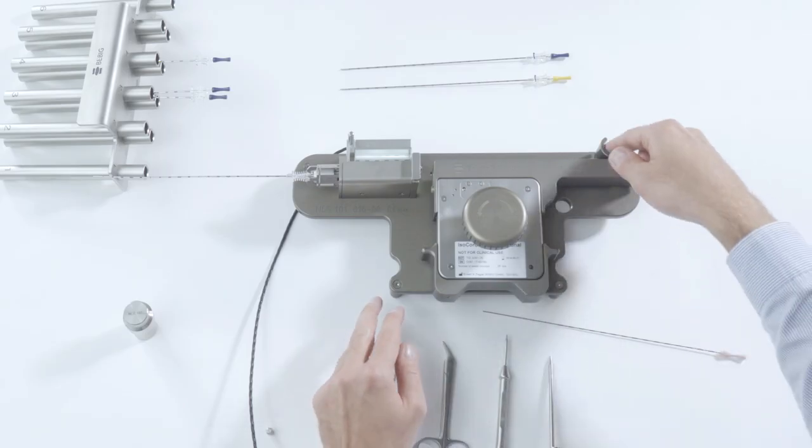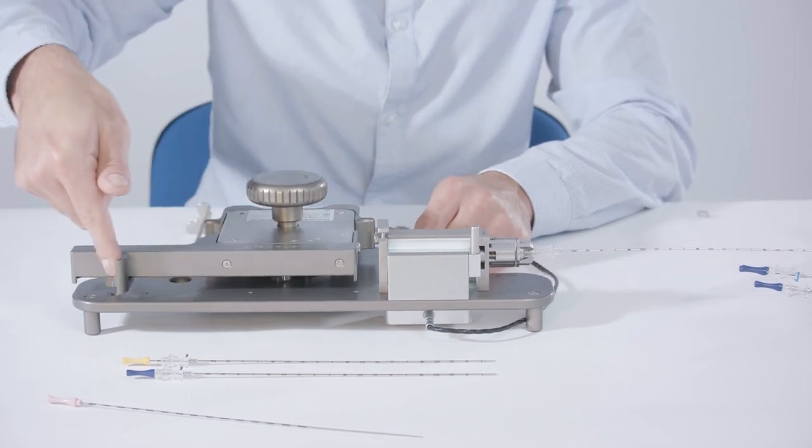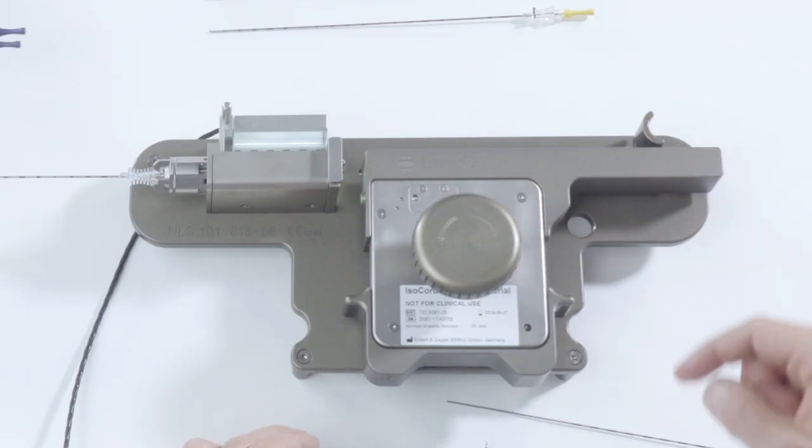Push the stylet by its handle as far as it will go and then return it to its original position in order to load the attached implantation needle with the cut section of the chain.